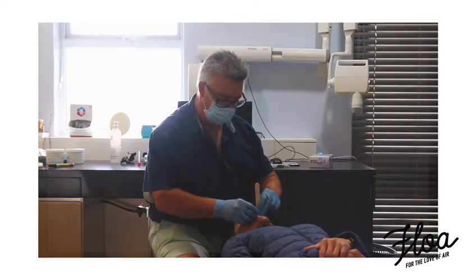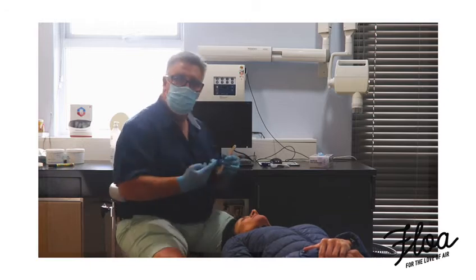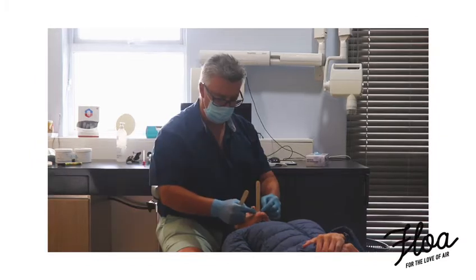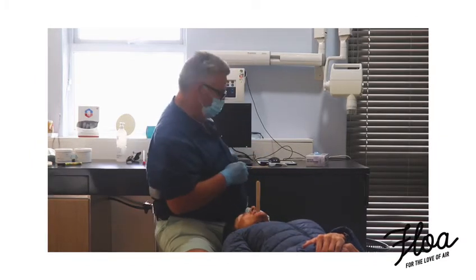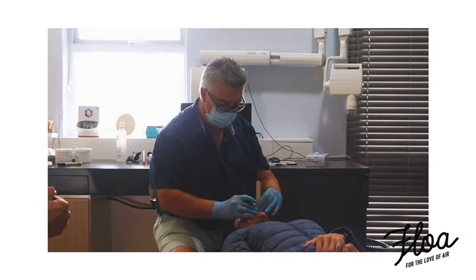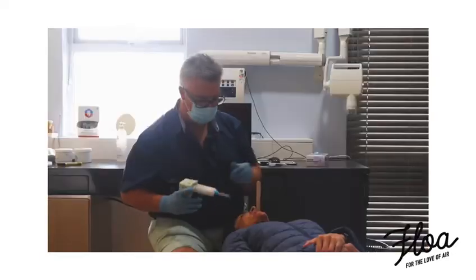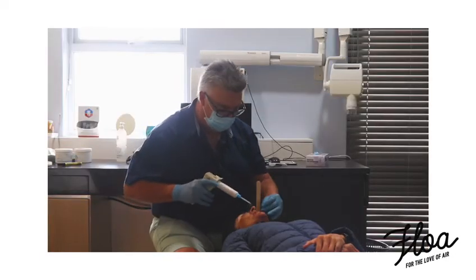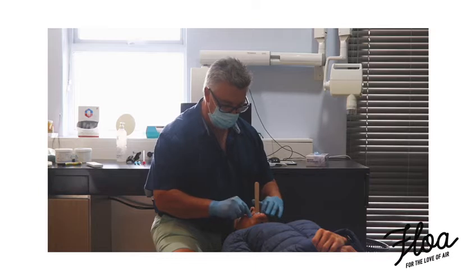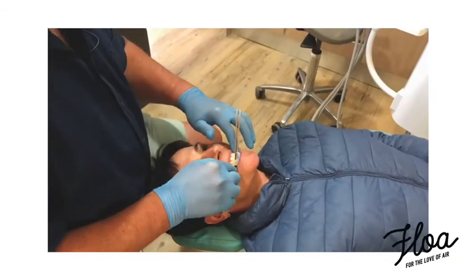That's excellent. Same thing — take our third stick. The idea is just to do a comparative analysis. Your ear gets better and better at doing this. Because you've got the putty on there, things stay pretty stable where they need to be. Let's make a final little mark so we don't lose our position. Now we've got to get everything nice and stable so the jaw stays in that position when we scan. Easiest way: jet bite, temporary material, putty — whatever you've got handy. Now we can fix that position. You do not want any movement while you're busy scanning, and very often once we put the scanner inside, the jaw starts compensating. So if we can lock it in, so much the better.